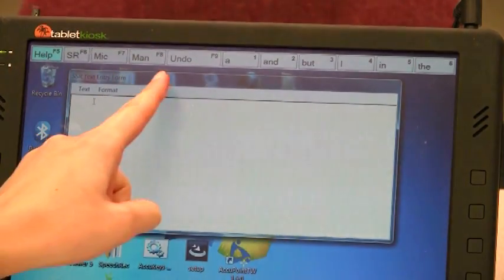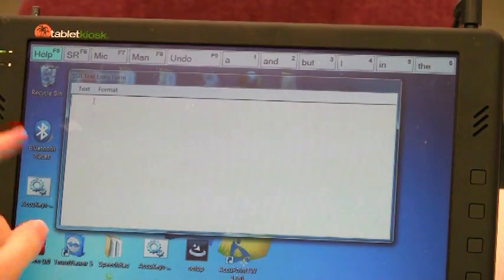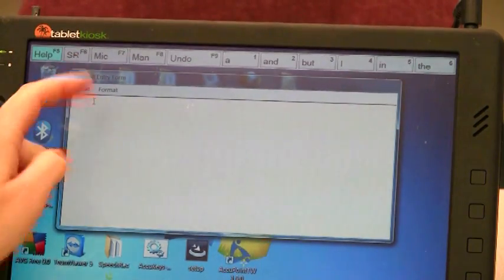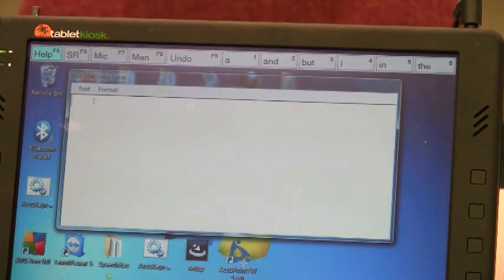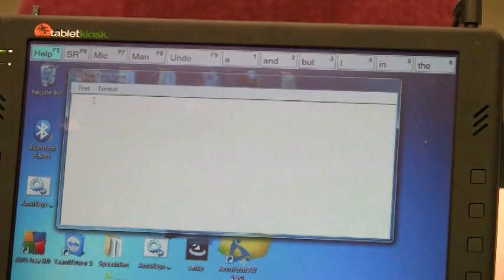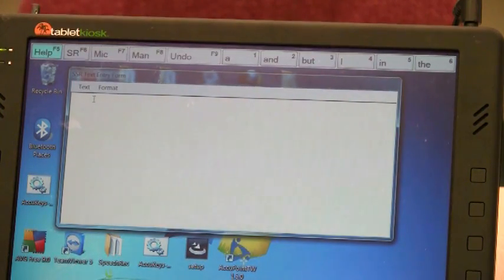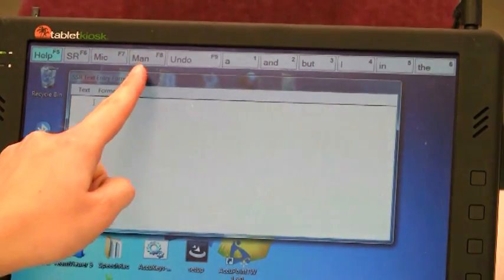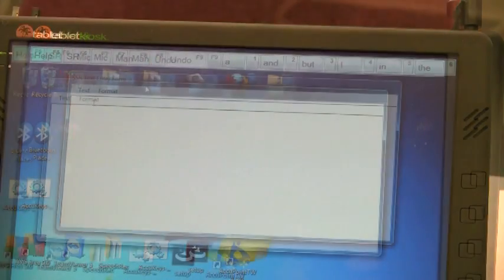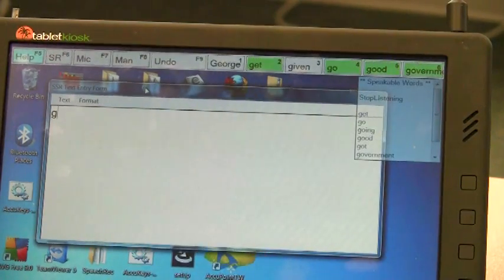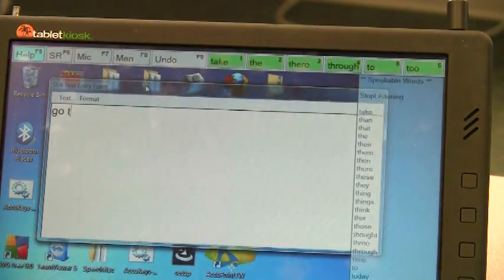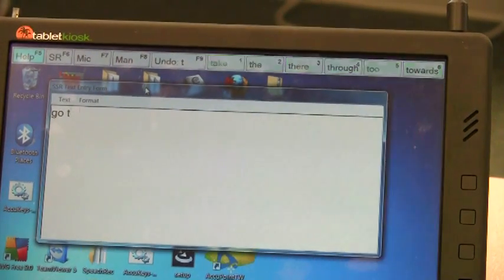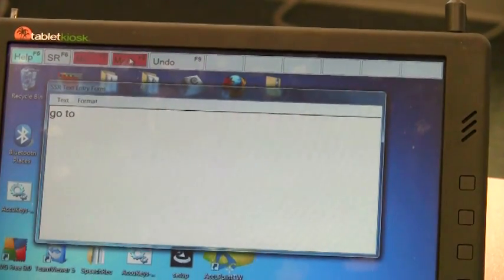The first five buttons on the left control the program. Clicking on Help or SR opens menus for setting user parameters and configuring the speech recognition system. Pressing the button labeled Man stops the SSR software and lets a user type without speech or word prediction help. This is useful when entering text such as website addresses.